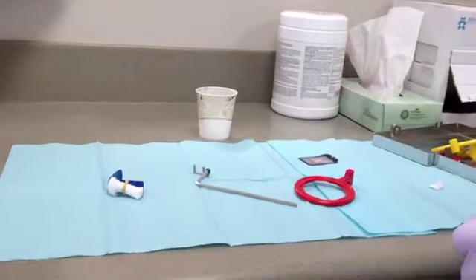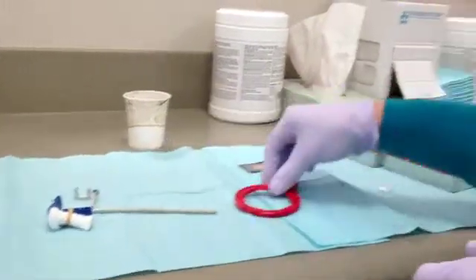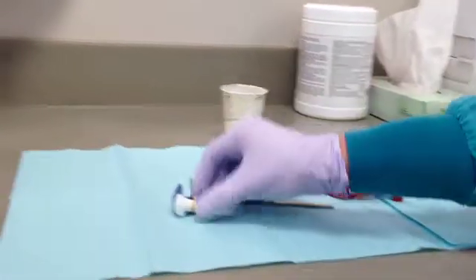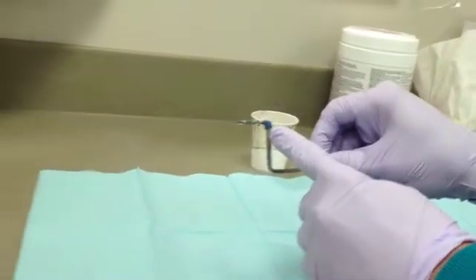The XCP consists of three parts: the bite block, the steel rod, and the ring attachment. For a periapical radiograph of a maxillary lateral incisor, one would need to use the blue anterior bite block, the rod that has a blue band, and the centered ring.